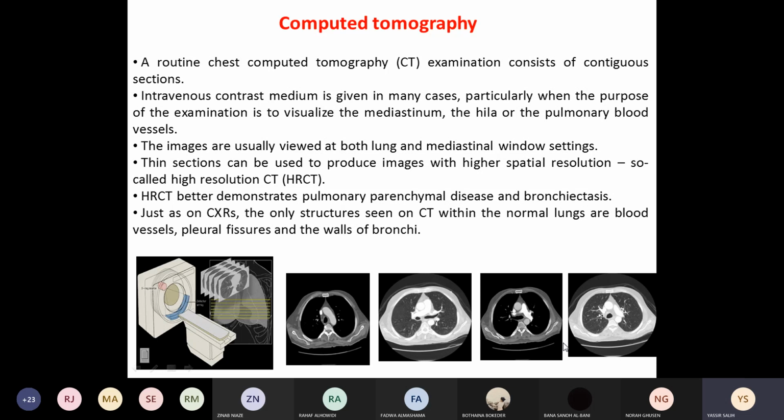عندنا الثاني تكنيك اسمه high resolution CT اللي هي CT done with high resolution. يعني بتكون عندنا thin section، ناخذ very thin section for very small lesion. فدينا more details for very small lesion or for more detail of the lung parenchyma. ده بسموه شنو high resolution CT.